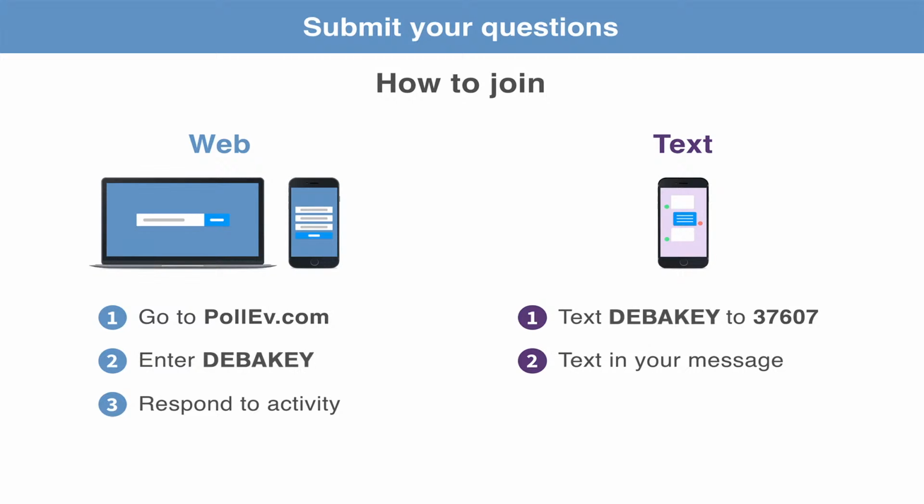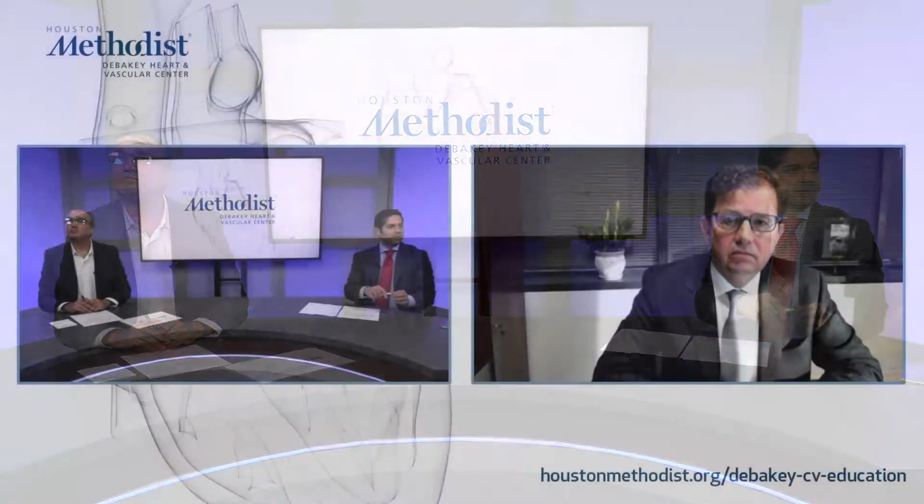So the question is basically, acute cellular rejection has become less of a problem. Do you have any data suggesting a prognostic role of high ECV in the patient who had no typical rejection, meaning the adverse immune interaction with the heart beyond cellular rejection, and with need for an imaging marker in this adverse reaction? So I guess it's asking, cellular rejection has been validated in a lot of studies, but antibody-mediated rejection and non-HLA rejection have been more challenging for us to define and diagnose in the transplant. Is there any data for those types of rejection versus acute cellular rejection that imaging can help us with?